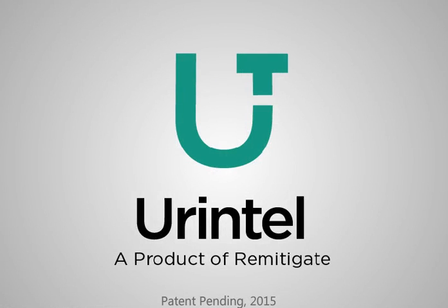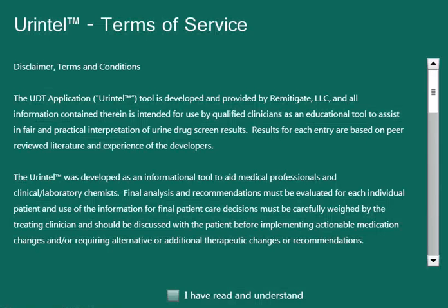Hello, this is Dr. Jeffrey Fudin, bringing you a demonstration on Remitigate's new Urintel software application, which is intended for use to help determine the results of urine screens by immunoassay.